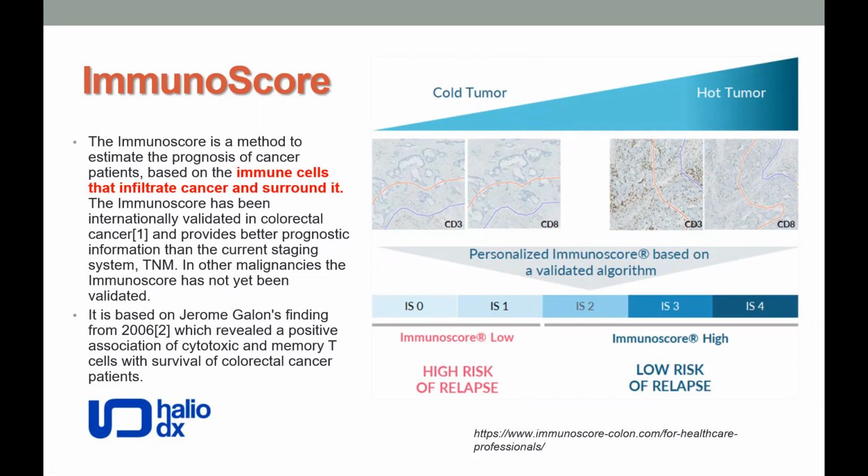And just by looking at this quite easy to apply criteria, although it's not as quantitative because mainly this is done by pathologists, currently a company spun out from the original research group is trying to develop a computational approach to do that. Now you can classify your tumor into two or several different categories, either immunoscore high or immunoscore low.